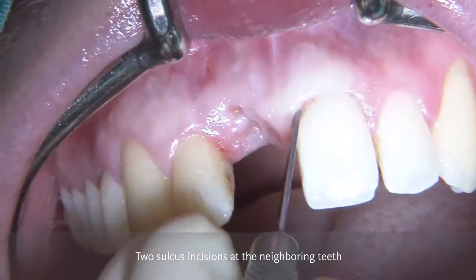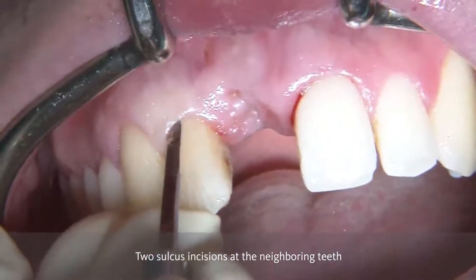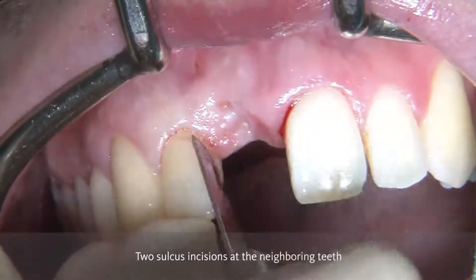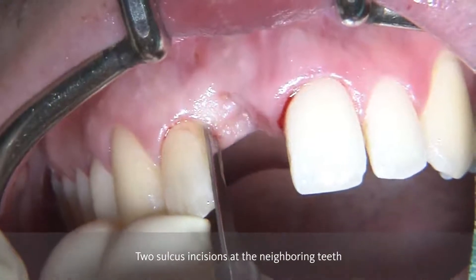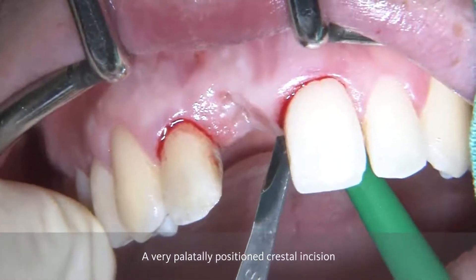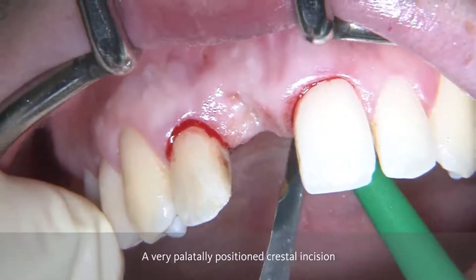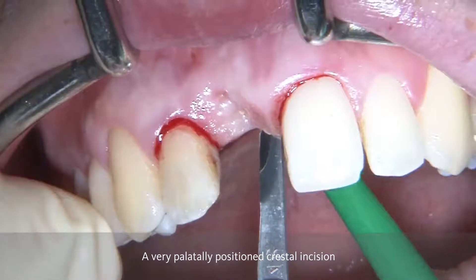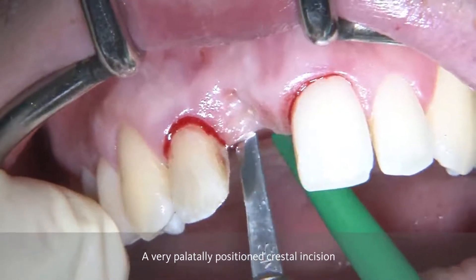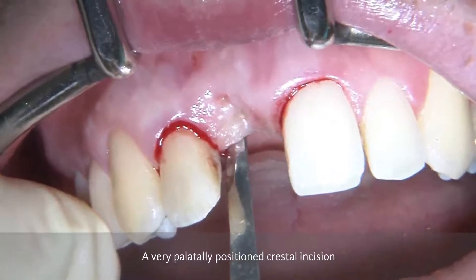In order to access the area of regeneration, we're going to do two sulcular incisions at the neighboring teeth with a micro blade and a very palatally positioned crestal incision. In order to be able to do a GBR procedure on the buccal aspect, it is mandatory to have a vertical releasing incision.